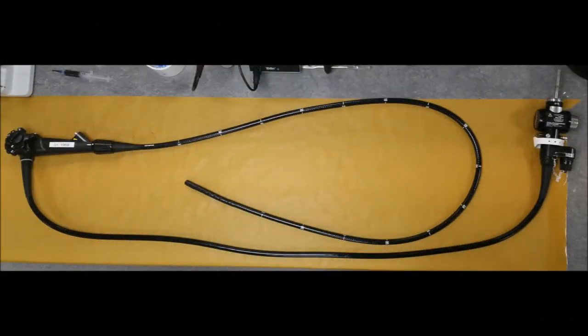Here is a picture of a typical flexible endoscope. The following pictures will show various parts of the scope to pay extra attention to whilst cleaning and leak testing.